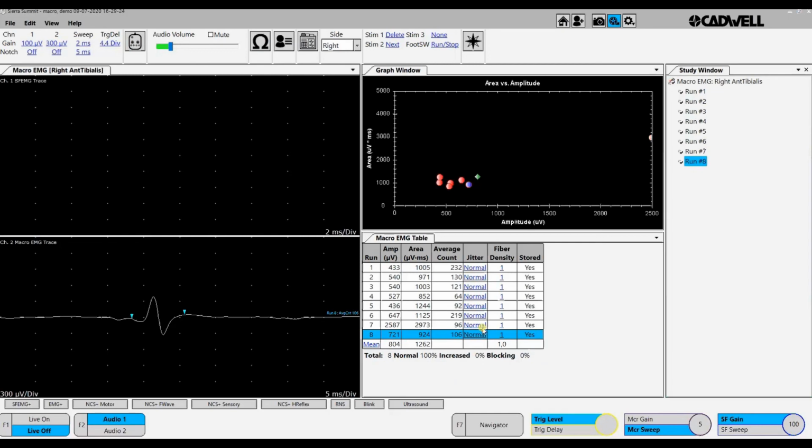And now we have obtained a number of motor unit potentials, and they are plotted here, the amplitude versus area, and usually they are correlated like a linear correlation. If we have large amplitude, also large areas and so on, but we report the amplitude. In this case it was 800 microvolt, a slight neurogenic picture because this has been a muscle with an L4 L5 radiculopathy earlier.